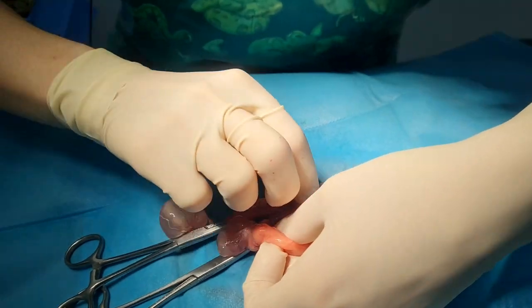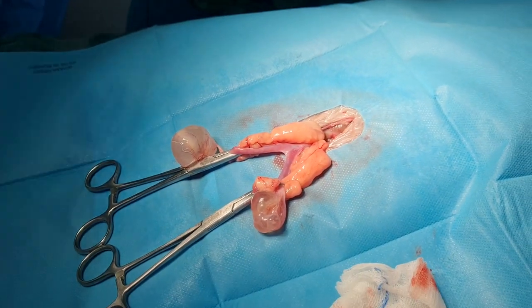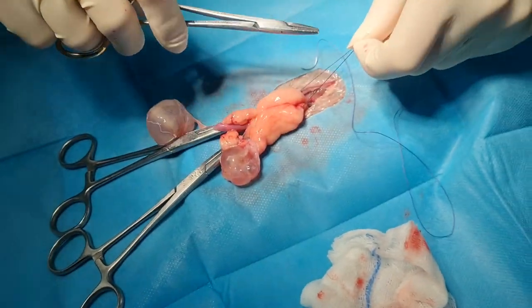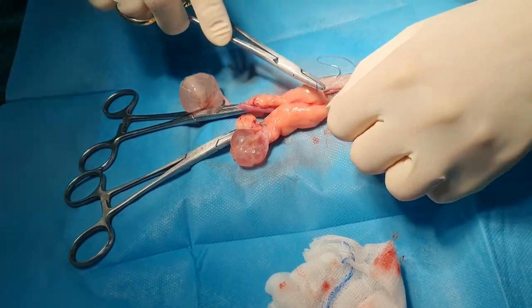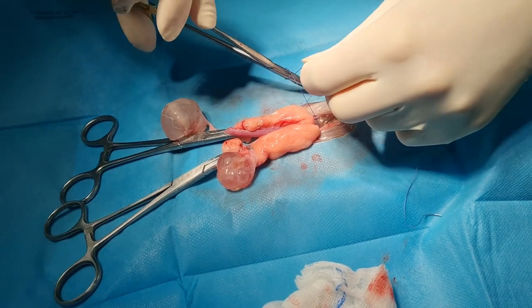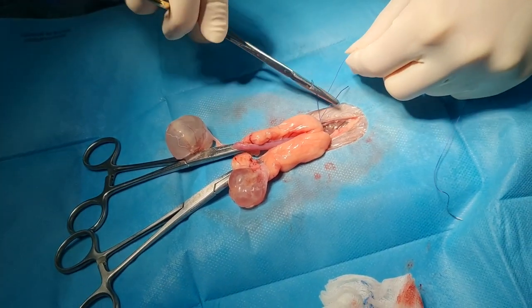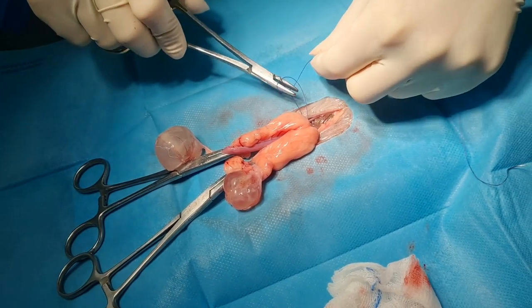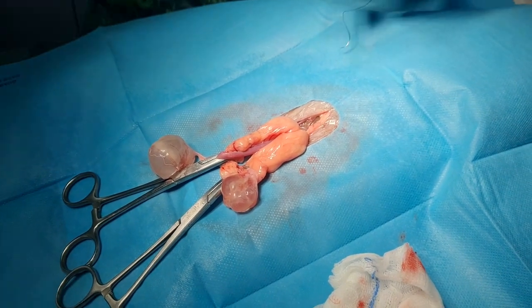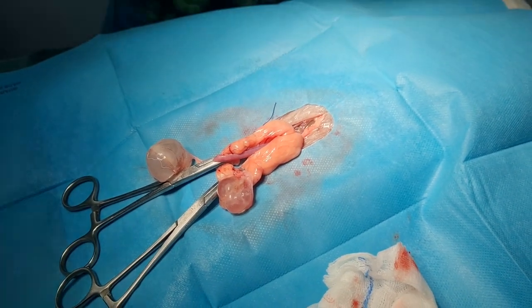There's our uterus. She just looks very hormonal, and she is a very hormonal pig. She was actually showing signs of oestrus yesterday — she was being very flirty at home and pulled her sister off this morning. Her sister had the same operation on Monday, two days ago, and if you look at her now you'd have no idea she'd had major surgery. Her cysts were three or four times the size of these — we did not get them out intact. So this is definitely a pretty modest cyst.